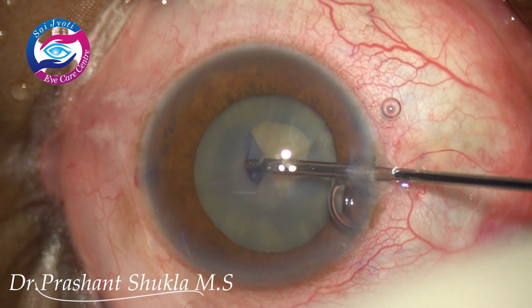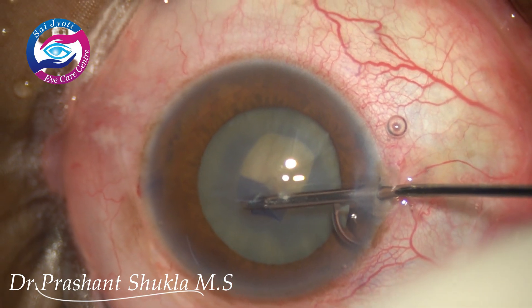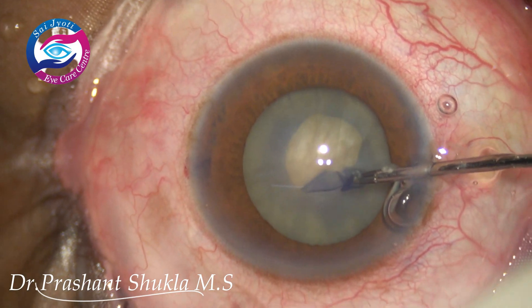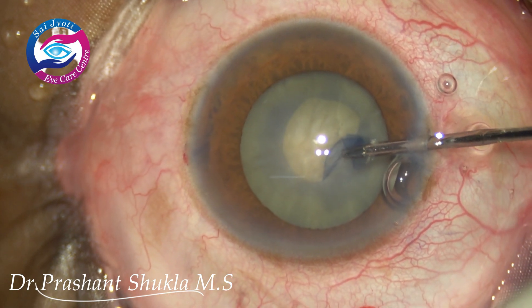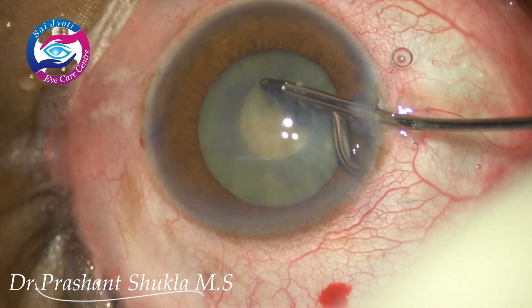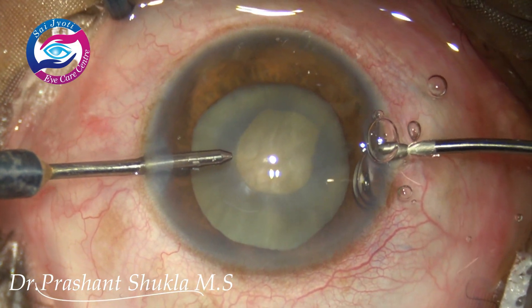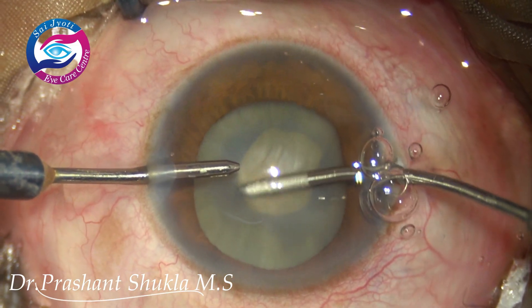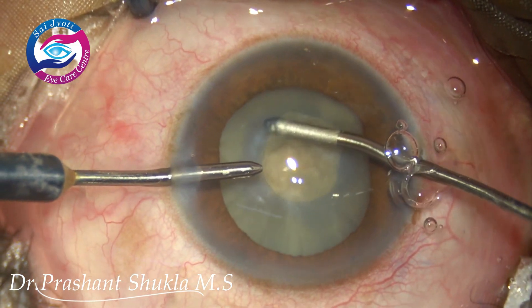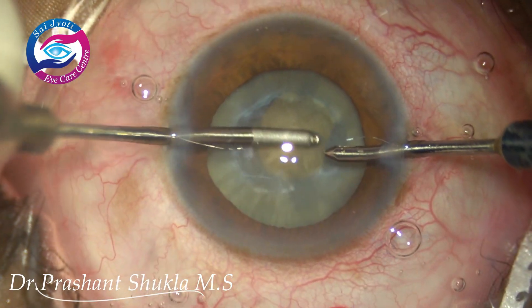Although there is not much fluid in the eye, we had a capsular extension while operating the other eye, so there could be hidden pockets of fluid. I am planning to do a small rhexis first. I have still not made the scleral tunnel and I am decompressing the capsular bag using bimanual irrigation and aspiration with a vacuum of about 300.